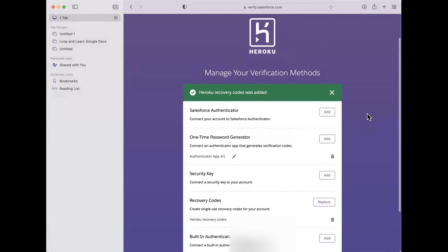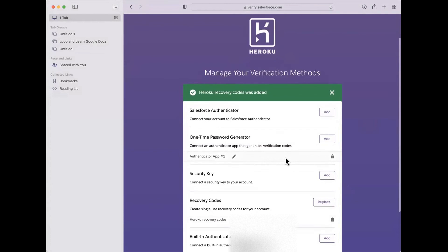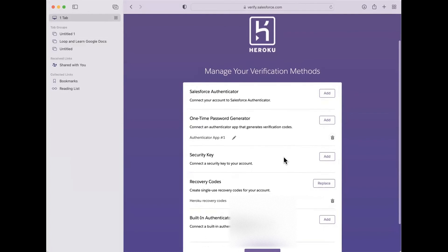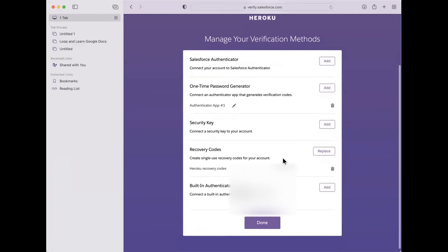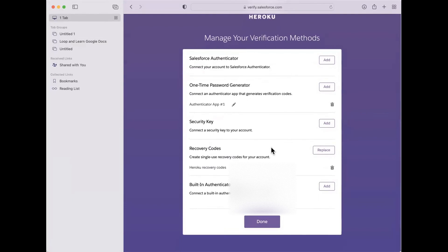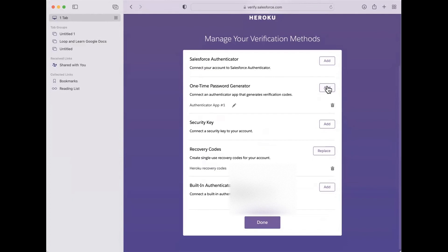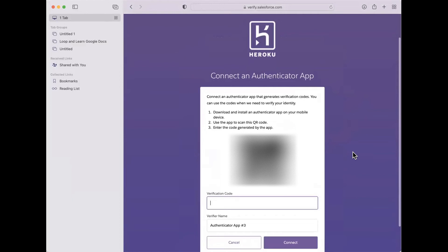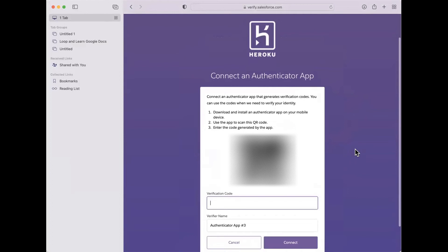Once you've done that, you'll come back here and you will add an authenticator. I already have my authenticator app, but you'll hit add. You'll then open an authenticator.